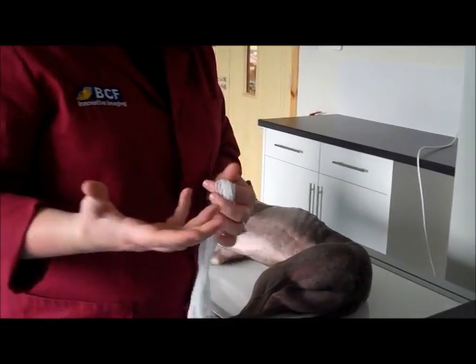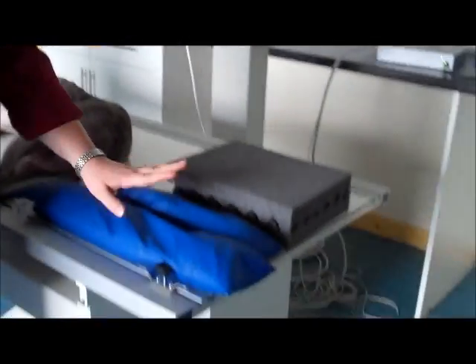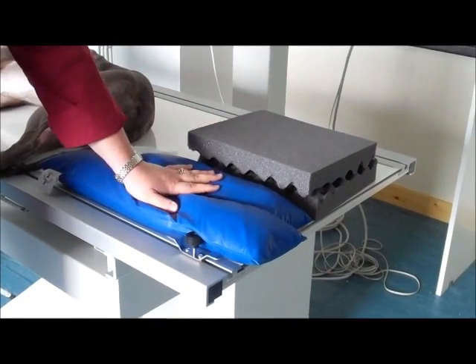We'll look at some of the bits of equipment that we need to perform this correctly. One bit is some form of restraint. You can get a number of different things, whether they're purpose-made bits of cord to restrain the limbs, or what I tend to find around the practice is a bit of bandaging gauze, which works really well. You'll also need some foam wedges and some sandbags.